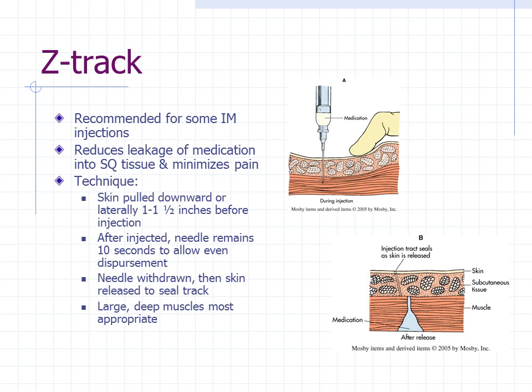So you're going to pull the skin the same direction as the body. You're going to hold it. This is, of course, after you've cleaned it. Then you're going to inject, allow the medication to disperse for several seconds, withdraw the needle, and then release the skin.